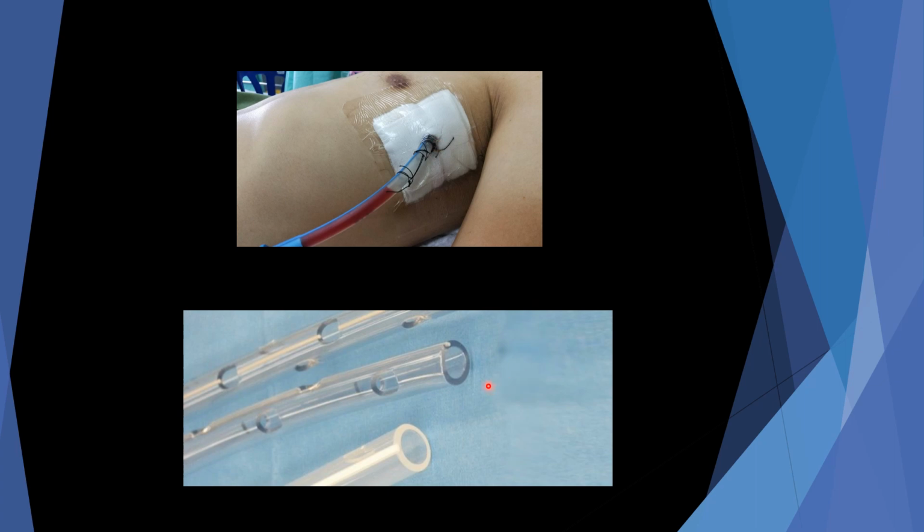When you take a closer look at the chest tubes, you're going to see that the chest tube has multiple holes in it. That's going to help facilitate drainage of both fluid and air out of the lung. But one thing I want you to notice is this end piece right here. Look how blunt that is. That is not a nice, comfortable looking tube if you ask me. These are large tubes, and they're blunt at the end. They're a little bit rounded on that tip, but they're very blunt, and that means pain. That's all I see when I see that.